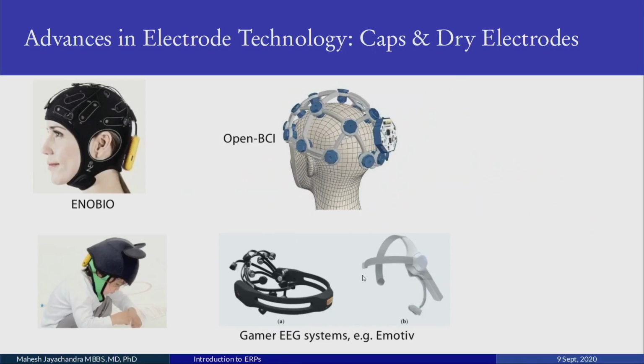So it's a painstaking method, especially when you have 40 electrodes or more. We have to mark each electrode and make sure that you're in the correct position. Current day technology has a cap where these electrode positions are pre-marked, so you just put on the cap. And also they use dry electrodes. With dry electrodes, the impedance of the electrodes is very high, anywhere from 50 to 150 K. But correspondingly, the input impedance of the amplifiers is much higher, 10 to the 12, for example. Okay, so you get recordings. They'll be slightly noisy, but very good recordings within seconds.